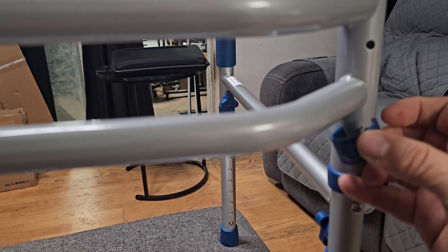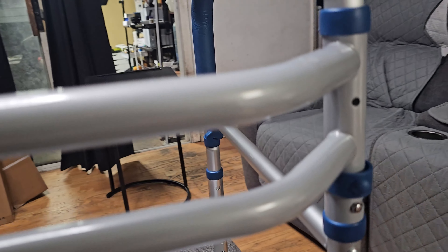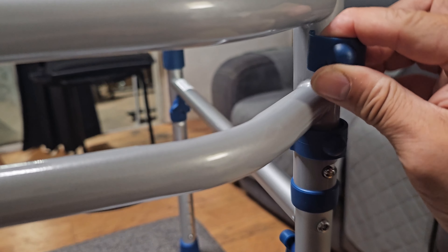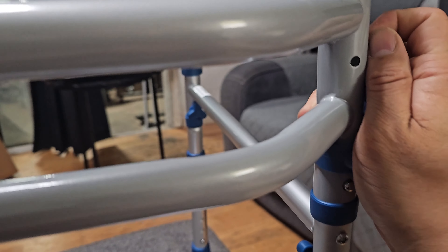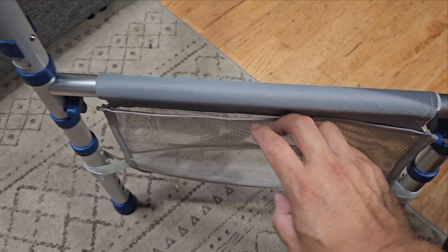We just finished assembling it. I want to show you these locks — they close and secure the system itself. They give you two for each side, so there are four total, and these keep the whole thing secure.